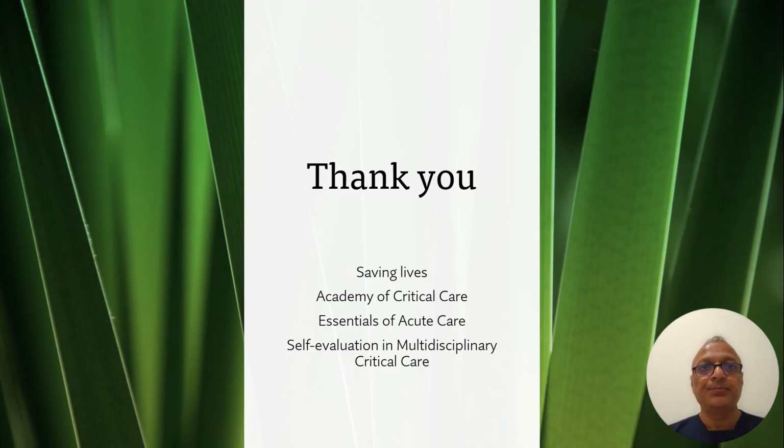So to summarize, PEEP is the maintenance of positive pressure at the end of expiration to recruit the closed alveoli in the lung and prevent them from collapsing at the end of breath. If appropriately applied, it reduces ventilator-induced lung injury in addition to improving oxygenation and increasing the compliance of the lung. Optimizing PEEP is a controversial issue and there is no agreed upon ideal method of determination of optimal PEEP.